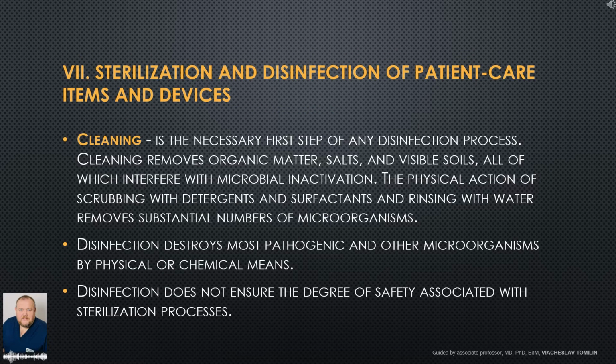Sterilization and disinfection of patient care items and devices. Cleaning is the necessary first step of any disinfection process. Cleaning removes organic matter, salts, and visible soils, all of which interfere with microbial inactivation. The physical action of scrubbing with detergents and surfactants and rinsing with water removes substantial numbers of microorganisms. If a surface is not clean first, the success of the disinfection process can be compromised.